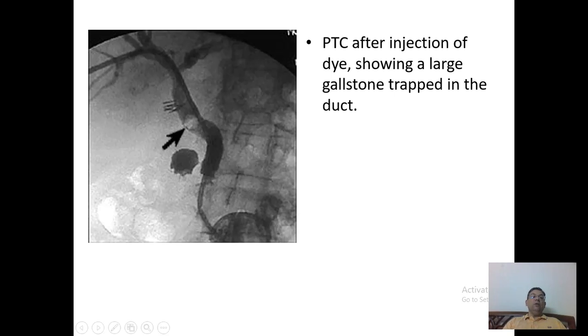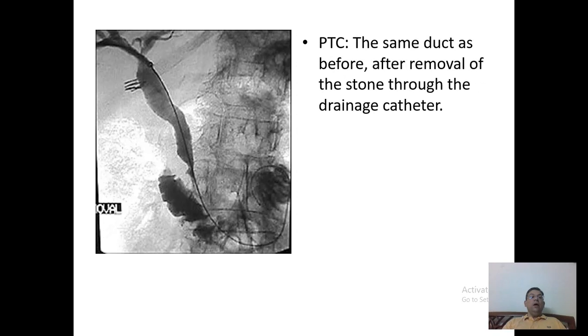Now they have found out that the cause of obstructive jaundice in this patient would be this stone in the common bile duct. अब क्या किया होगा उन्होंने? What can they do? They have removed the stone through a basket. यहीं से उन्होंने ये गाइड वायर डाली, ये कैथेटर है, इसमें से गाइड वायर नज़र आ रही है। इस गाइड वायर से उन्होंने एक डॉर्मिया बास्केट डाल के उस स्टोन को यहाँ से बाहर निकाल लिया। So it can be done like this.